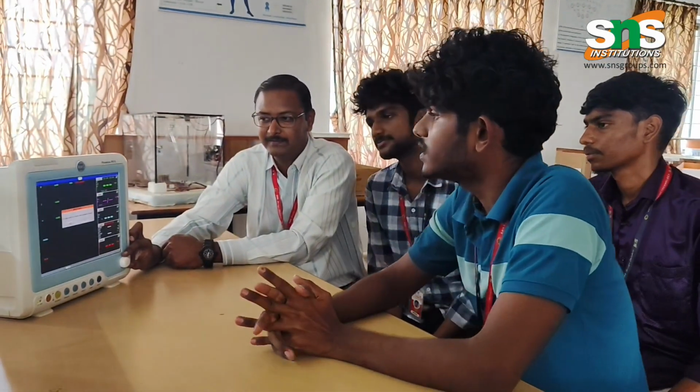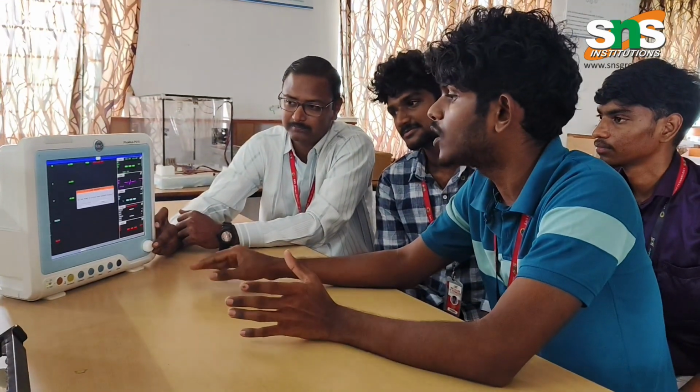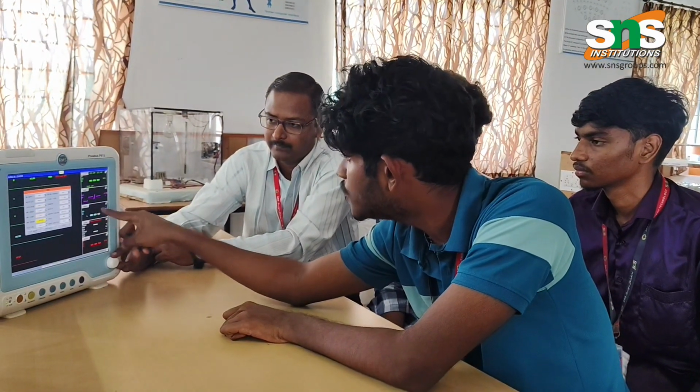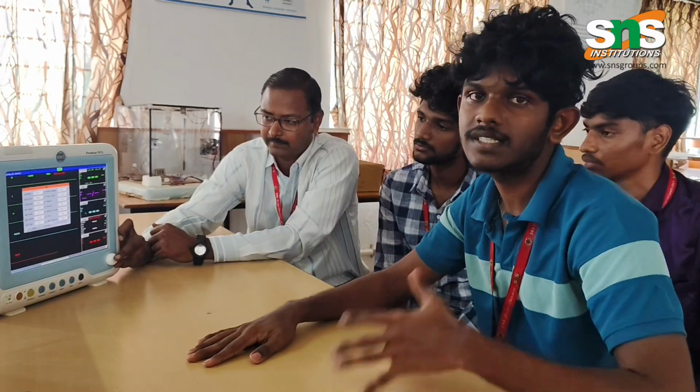Yes. So hi all. As Sir said, for every patient in the hospital, the first thing that is fixed is the patient monitor. Since we have to look into 5 parameters, this is a device which combines 5 major things. The first one is ECG, the second is NIBP, the third is SpO2, and then temperature and respiration. ECG, you all know, is connected with the heart.